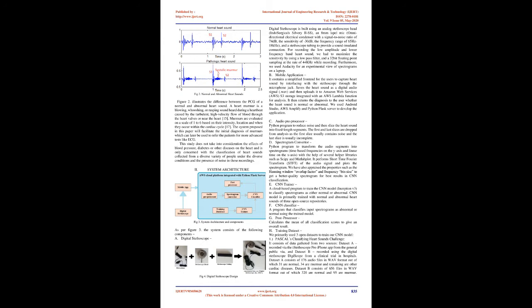C. Audio preprocessor. A Python program to reduce noise and then slice the heart sound into fixed-length segments. The first and last slices are dropped from analysis, as the first slice usually contains noise and the last slice is usually incomplete. D. Spectrogram converter.